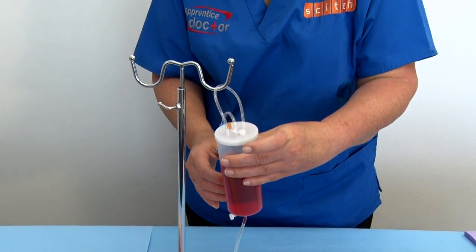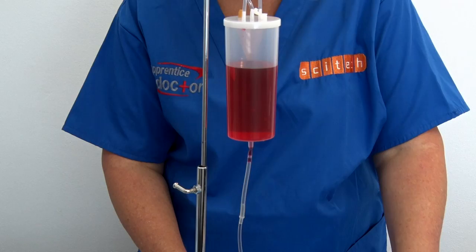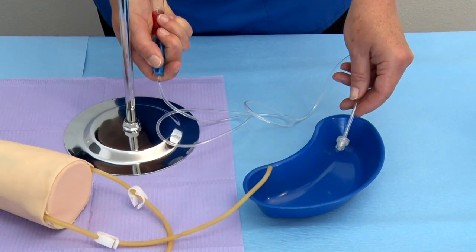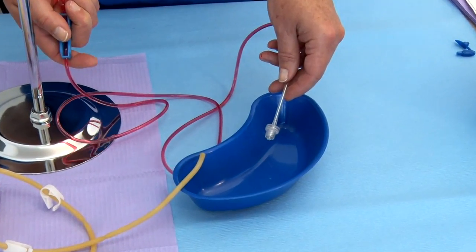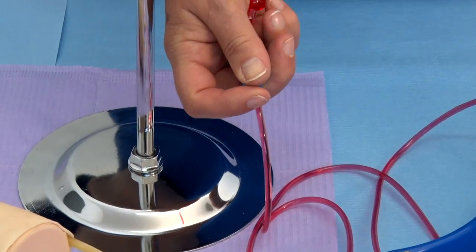Step 12: Suspend the reservoir container to the cross arm of the stand. Step 13: Press the drip chamber once or twice. Step 14: Open the outflow roller clamp and allow the fluid and all air bubbles to flow out of the tube and into the small container. Once all the air bubbles are out, close the roller clamp again.